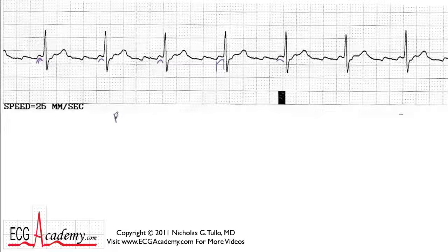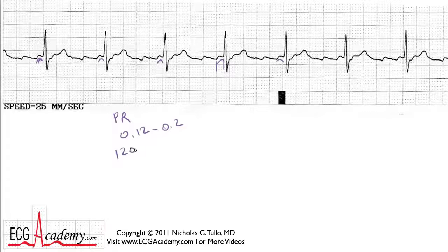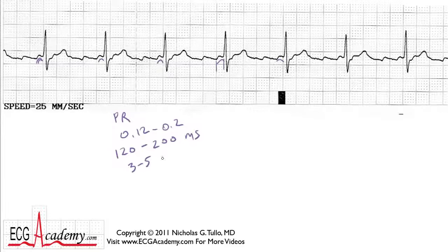What's the normal PR interval? The normal PR should be 0.12 to 0.2 seconds — or as electrophysiologists like to think in milliseconds, 120 to 200 milliseconds. For beginners, it's basically anywhere from three to five small boxes. That would be the normal PR interval. This really does look short — it's almost like two and a half small boxes, really not quite three.